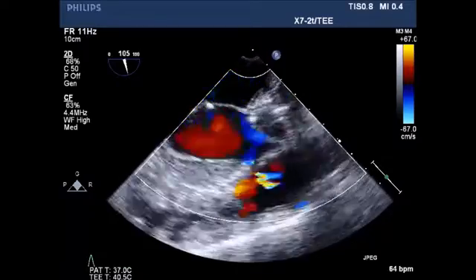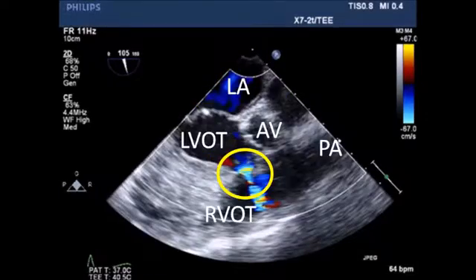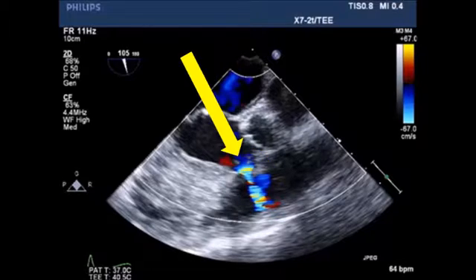Note that below the aortic valve, a jet indicated by the yellow circle identifies a ventricular septal defect with a left-to-right shunt. The yellow arrow also denotes the area of the defect.